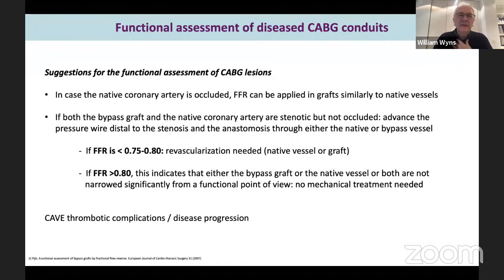My experience, and I think we touched upon it last time, and I think Azeem agreed, is that in vein grafts, FFR is not that helpful. First of all, it's very difficult to have an abnormal measurement because even with stenoses, still the residual lumen is okay. And the problems are not so much hemodynamic related. The problems are related to thrombosis.